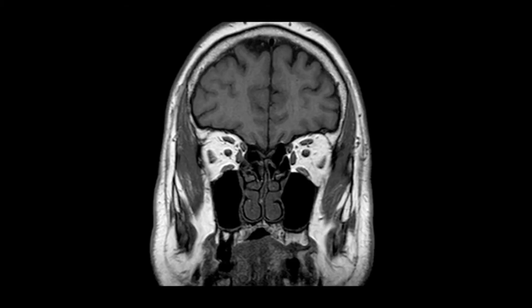Here is a coronal T1 weighted MRI scan. The CSF fluid is of low signal, and so this is a T1 weighted image. Here's the left optic nerve. You have four main extraocular muscles that are called the rectus muscles: this is the left superior rectus muscle, this is the left lateral rectus muscle, this is the left inferior rectus muscle, and this is the left medial rectus muscle.